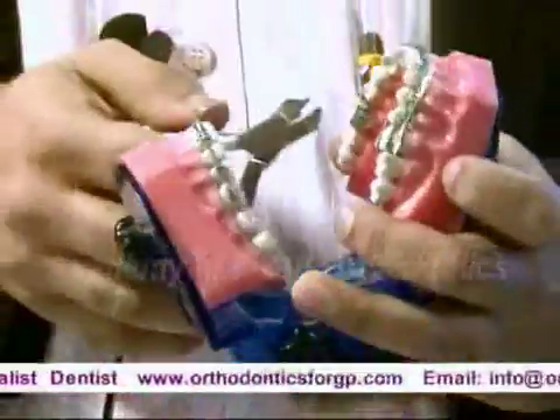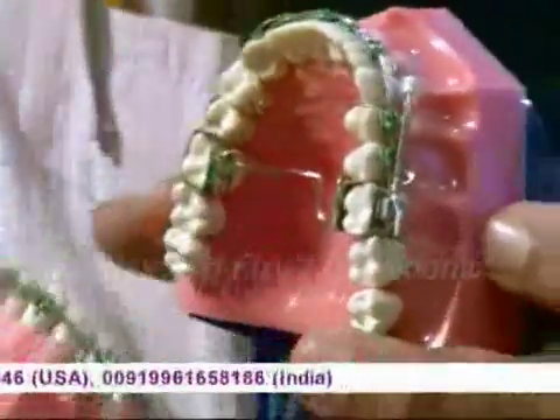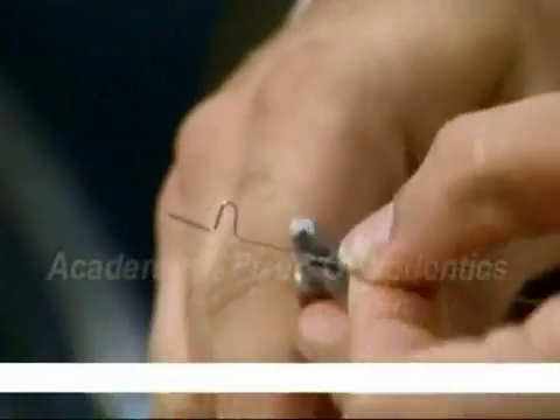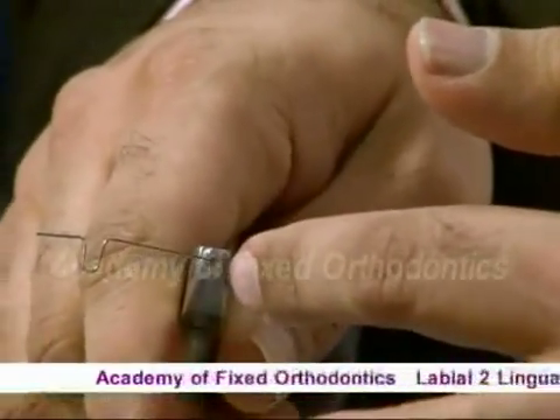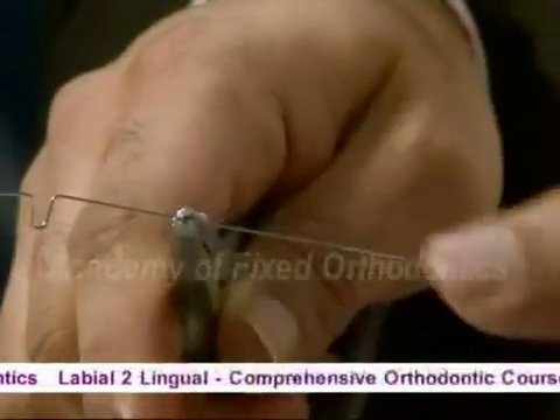This can be used to adjust — can you see? So you bring it forward a little bit, maybe this much here, one and a half inch forward.